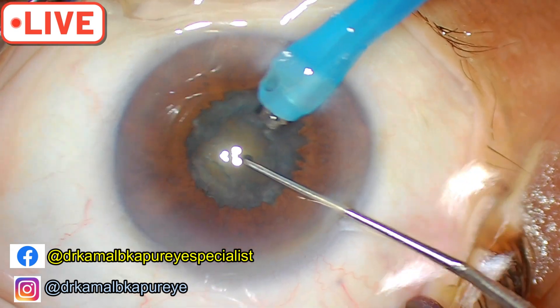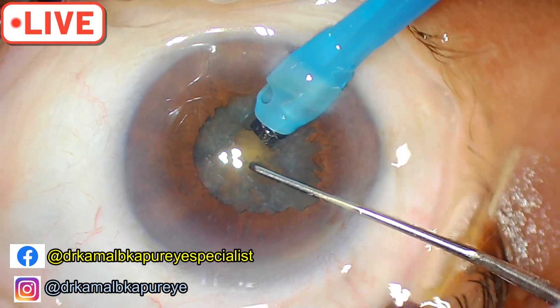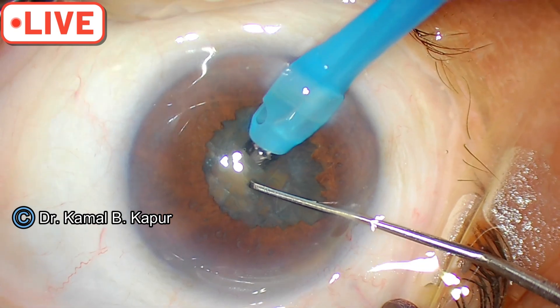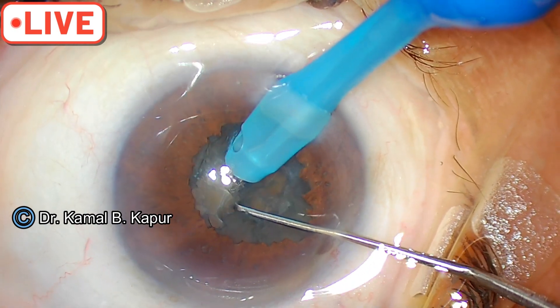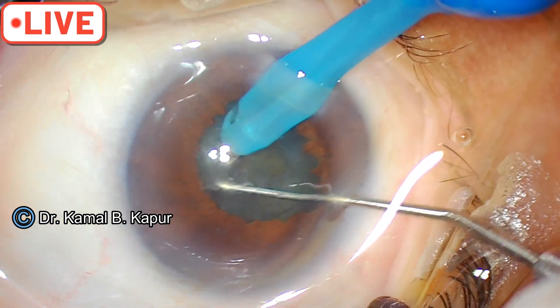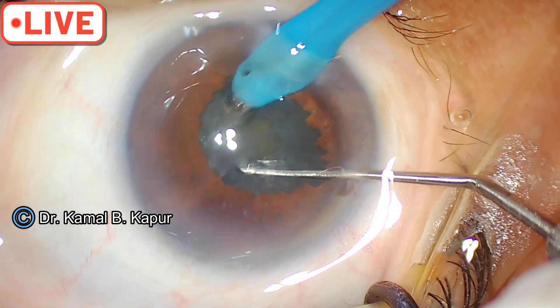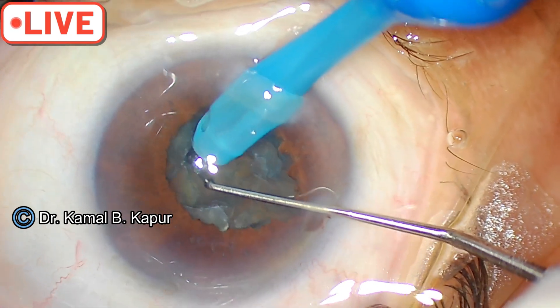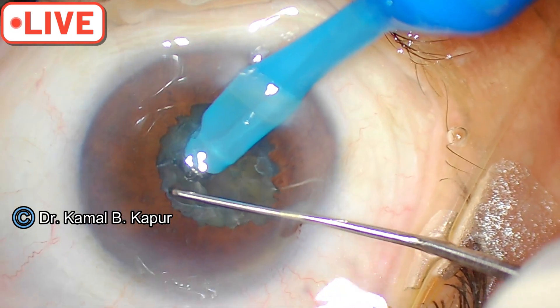Rotate the nucleus. We will attempt a vertical chop in this particular case. And we have done a vertical chop. As I said, vertical chops come very handy where pupils are small — you have a smaller axis, and it is an ideal go-to technique to chop.